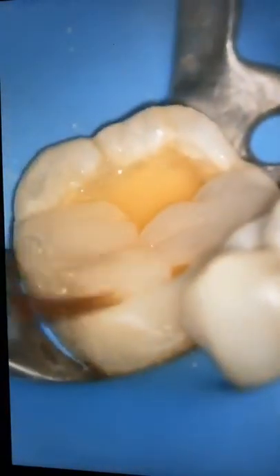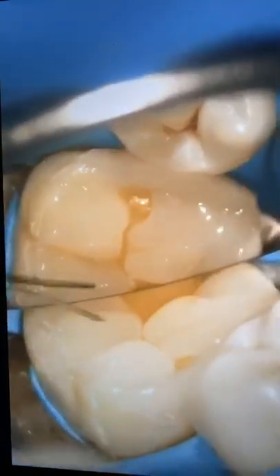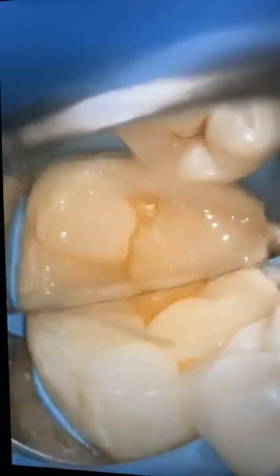And remember the three steps, yeah? The first step is take a big amount of composite with the condenser, with the plugger, and then give pressure, following the cusp's inclination. Adapt the composite well with the brush, and then create a separation with the blue spreader. After you see the gap, after you see the separation, it's time for your brush to make it close.